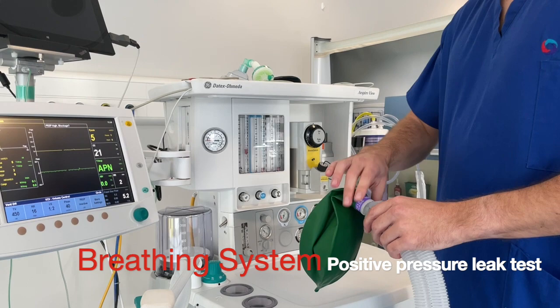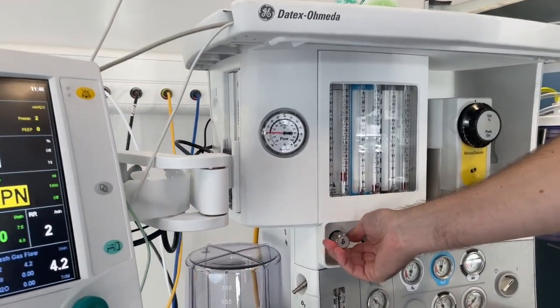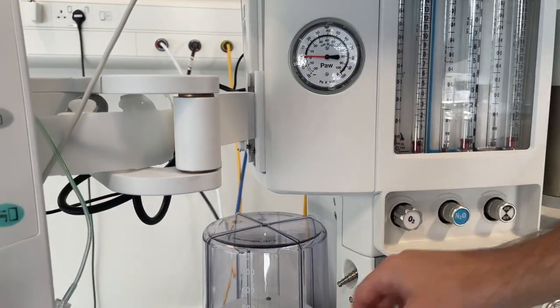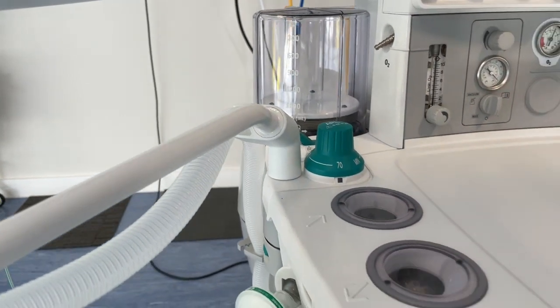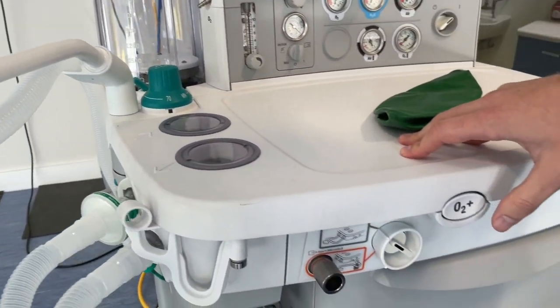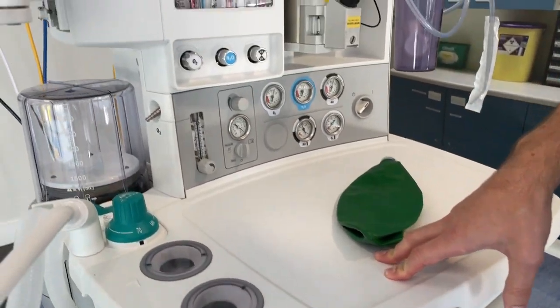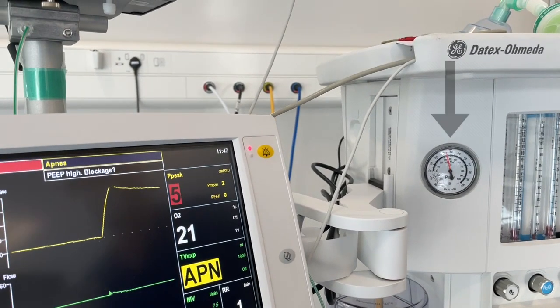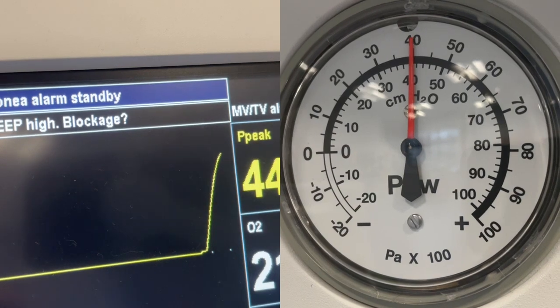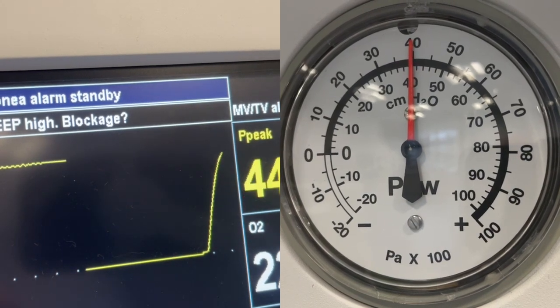Remove the bag and occlude the patient end of the breathing system. This test must be undertaken with all of the flows turned off. Screw the APL valve closed and pressurize the system using the oxygen flush button. We're now looking to see if any of the air that's in the system is leaking out, and we can use the pressure gauges on the anaesthetic machine to help us with this — whether you're using the analog gauge or the digital one on the monitor. If there are any leaks in the system you will see the pressure begin to drop.